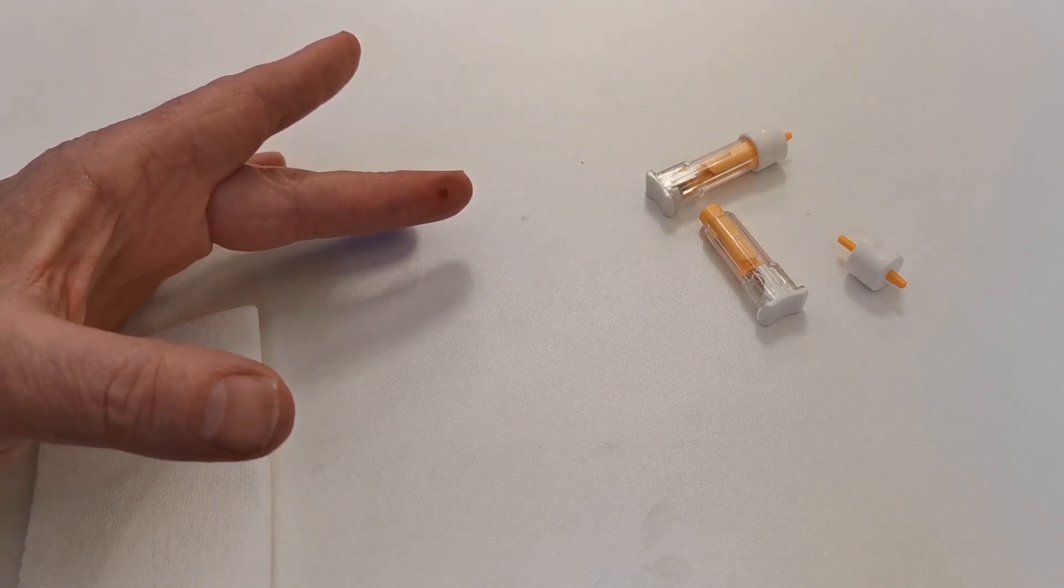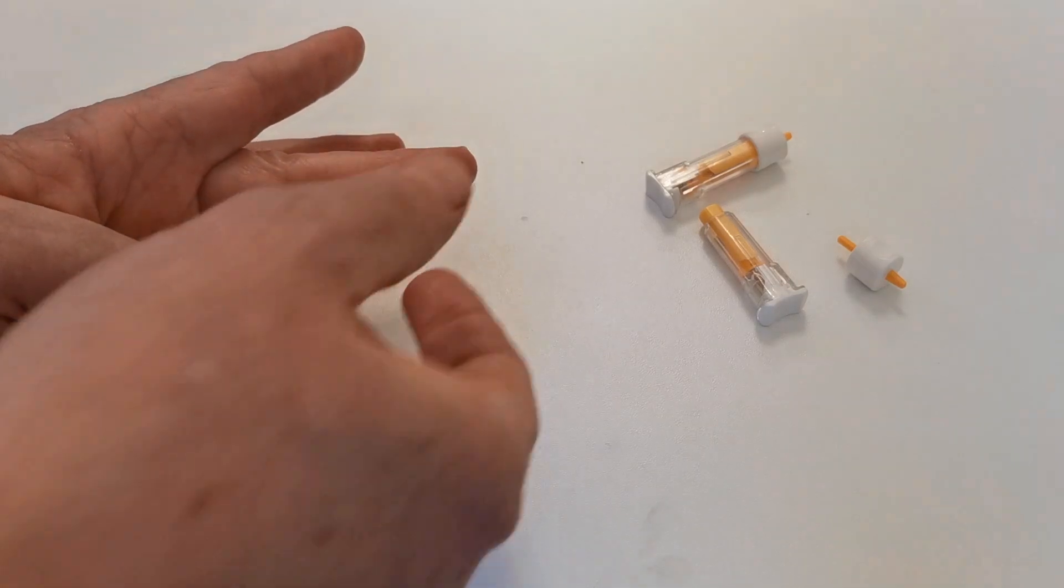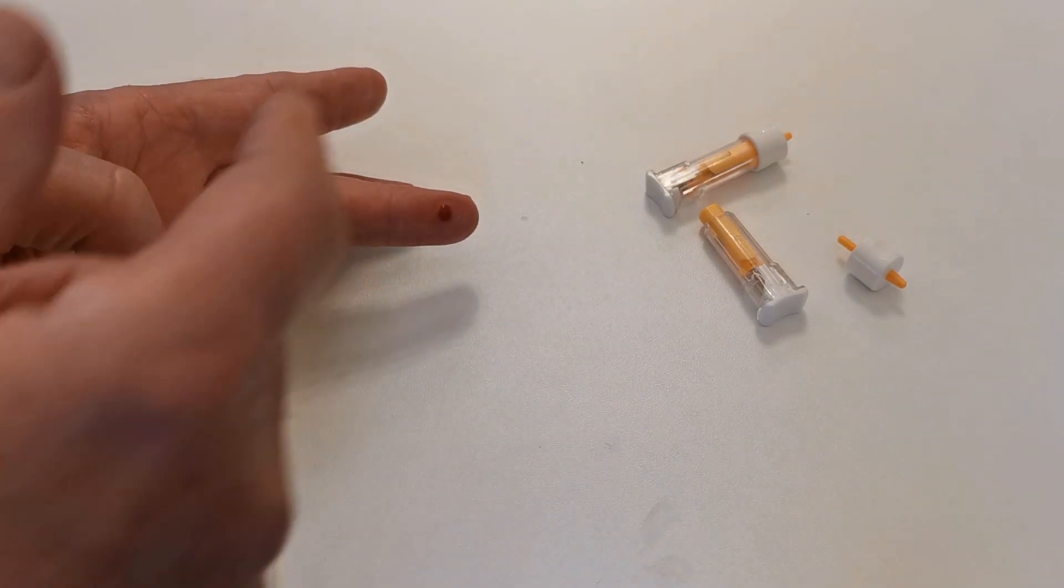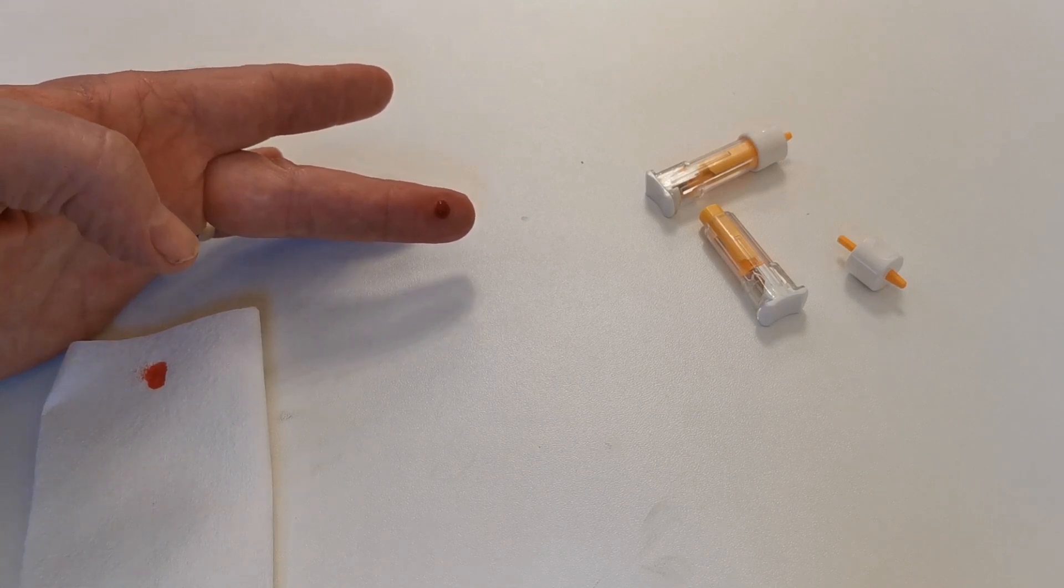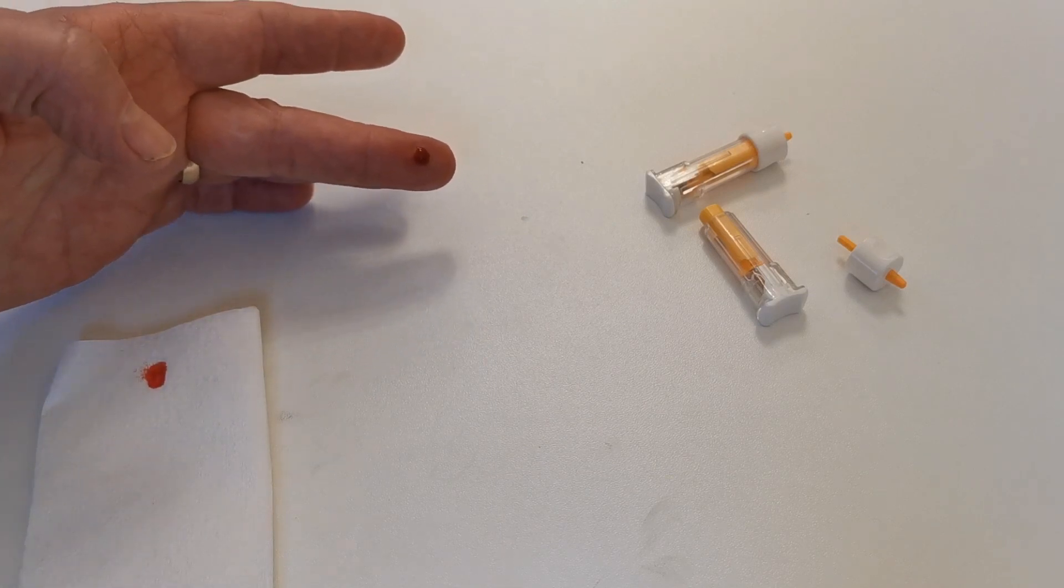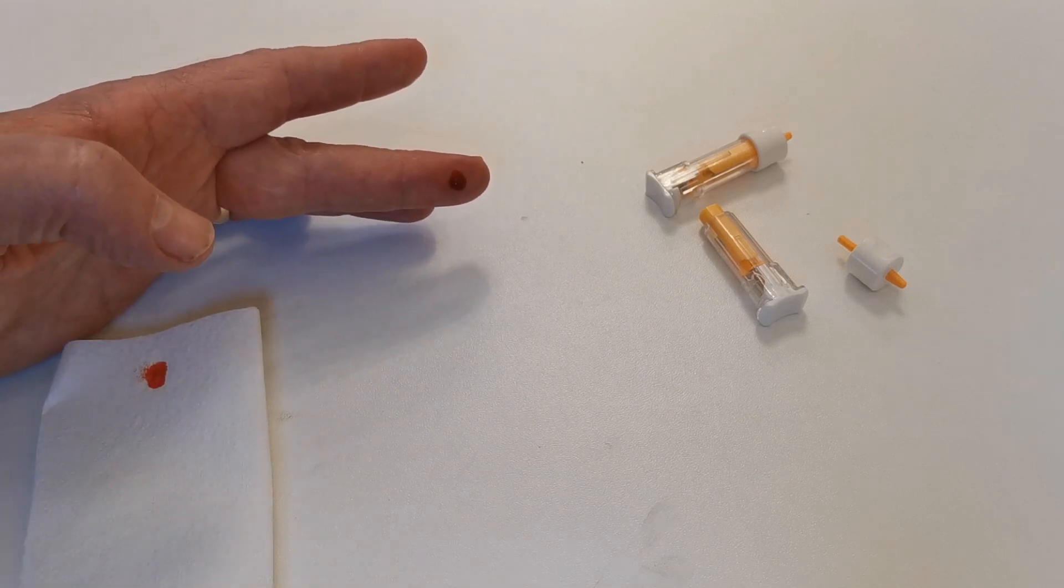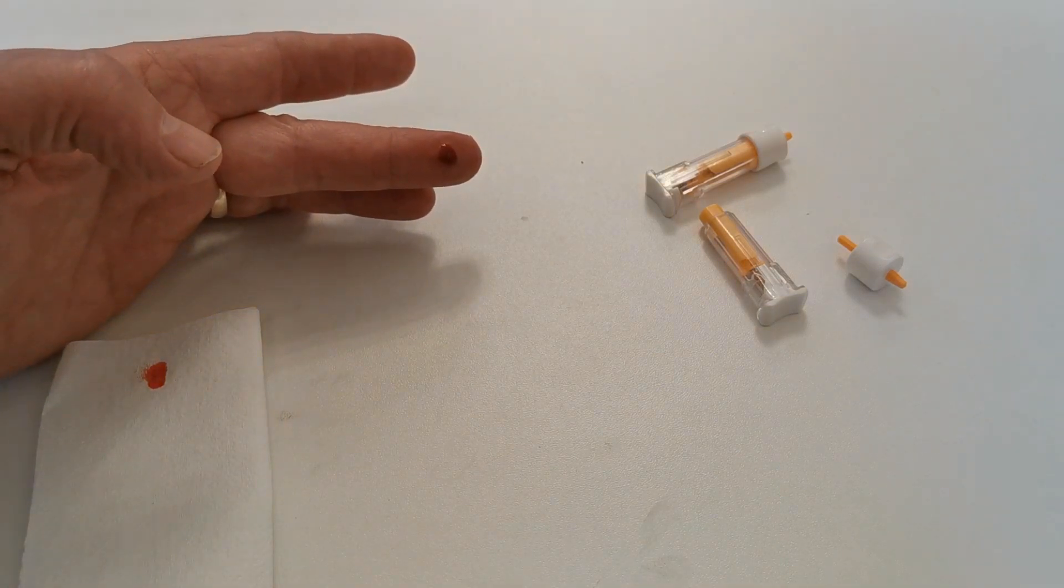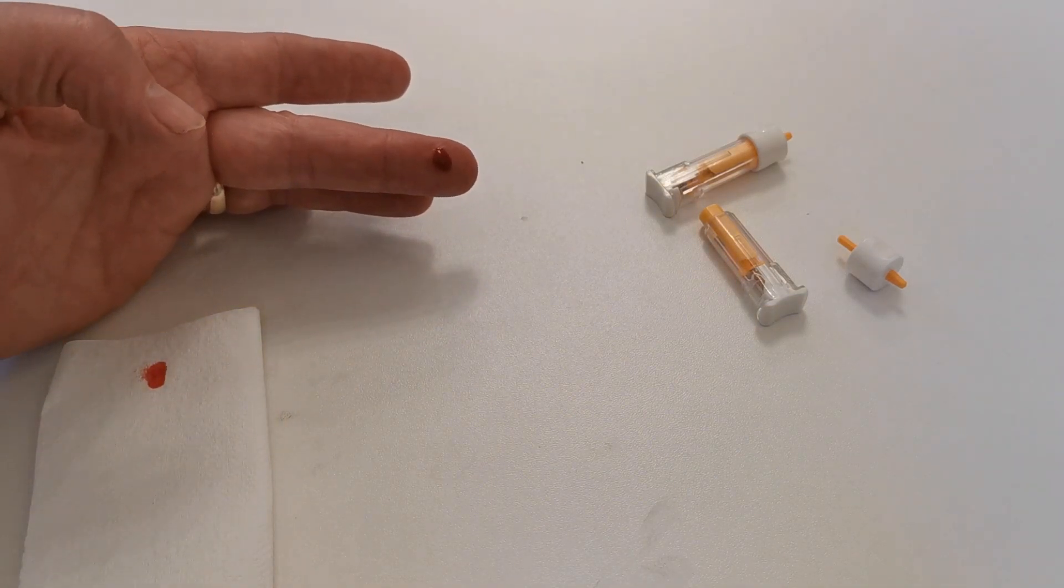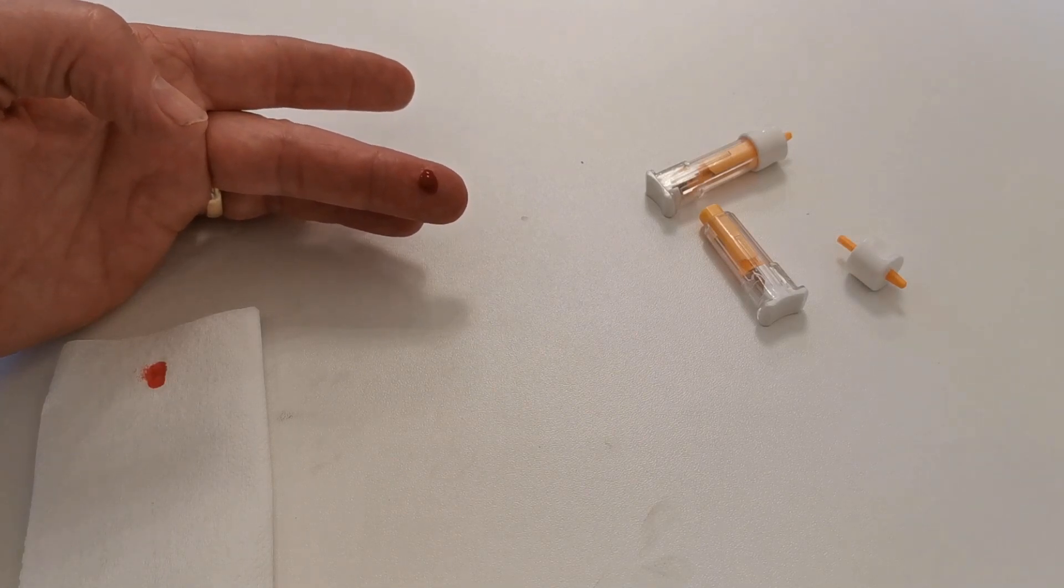This should occur quite easily without you having to squeeze or massage the fingertip. You'll note by the finger being completely dry, the droplet forms really well. This can now be applied to your test strip or test device and it's important that you use this second naturally formed droplet of blood to get an accurate test result. That's particularly critical if you're doing a hemoglobin test or a cholesterol test. That's a nice simple guide how to use these disposable lancets.